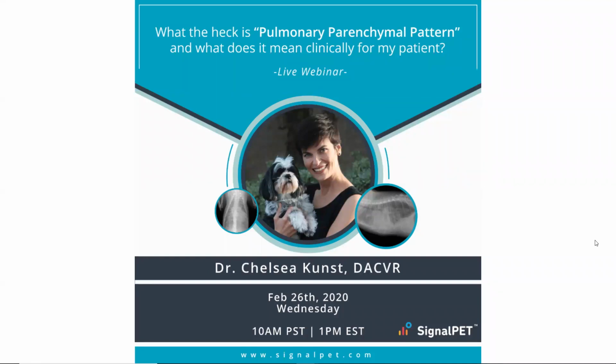The title of this webinar is, what the heck is a parenchymal pattern, and what does it mean clinically for my patient? At SignalPET, we've taught the system to recognize parenchymal patterns, which is different from the traditional way you may think of pulmonary patterns.